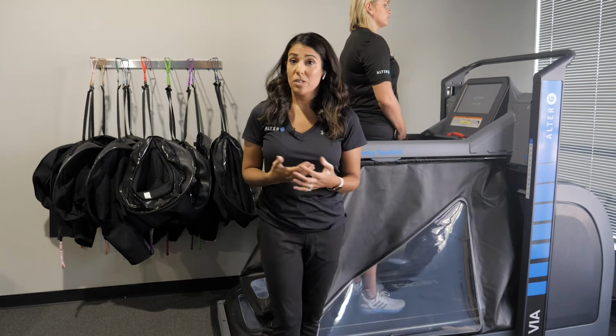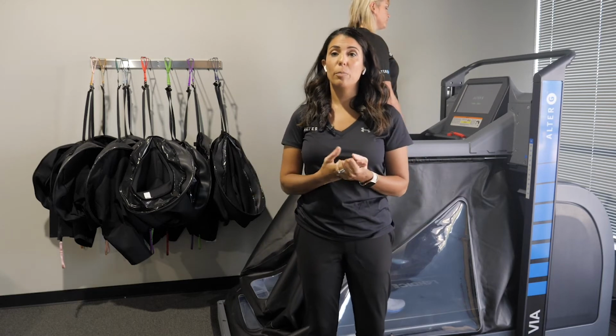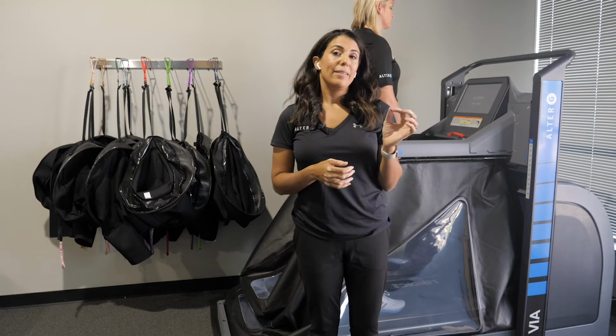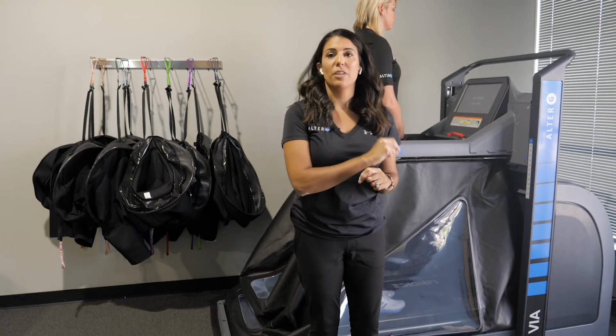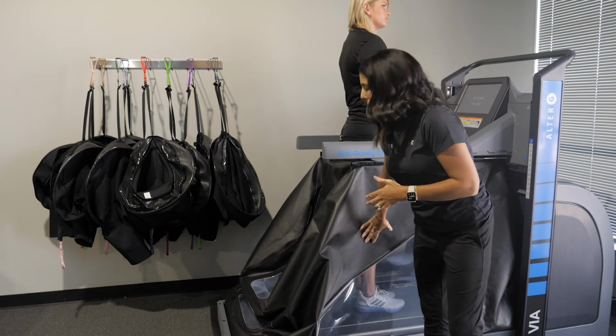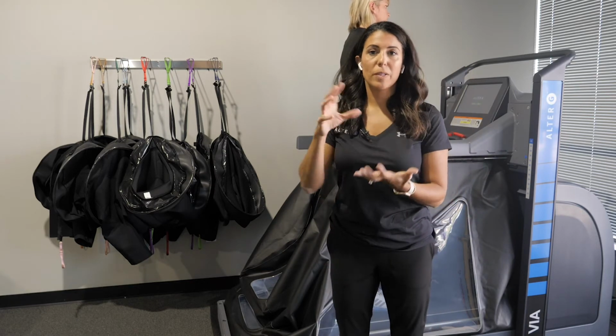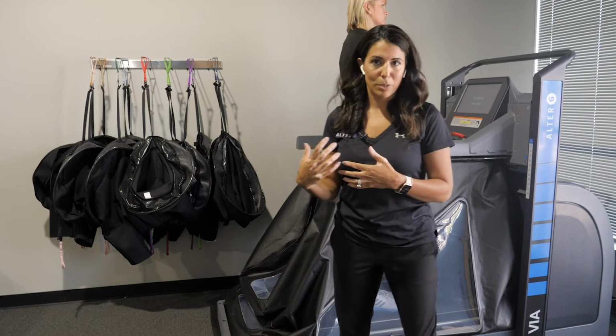What AlterG uses is we are the only body weight support system that uses differential air pressure technology. And the calibration is very specific to how we do this. The differential pressure technology, what that means is that there's more air inside of the bag than outside of the bag. And that differential air pressure is what allows us to unweight somebody inside of the machine.